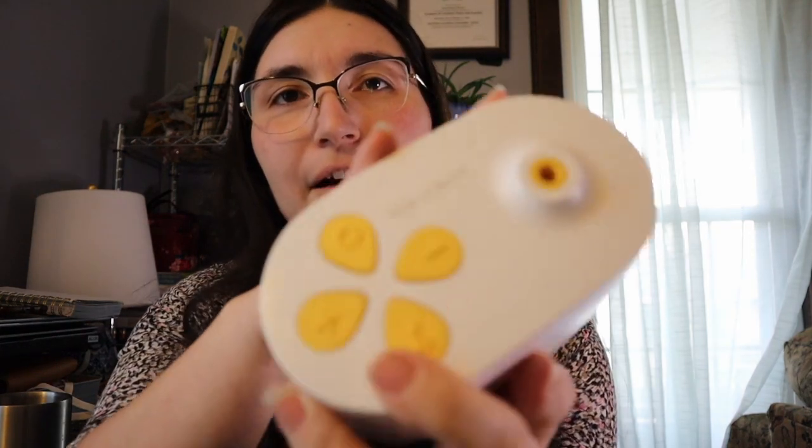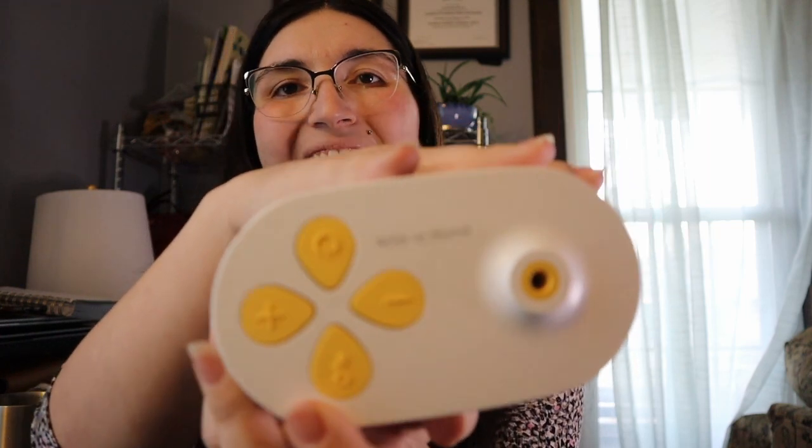So what I always recommend is playing with your pump ahead of time. Play with the cycles, see what works best for you. With a lot of pumps, and this is the Medela Pump and Style with Max Flow, the newer one, they have this little letdown button right here. It's like the little droplet. I know on Spectra pumps, people call it the bacon button, the wavy one. Some pump manufacturers call it massage mode or letdown mode. It is the shorter, faster cycle. It's less suction, but very fast cycles that stimulate the baby, frantically nursing, trying to get the milk to let down.